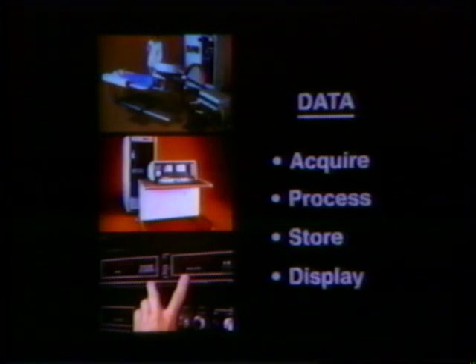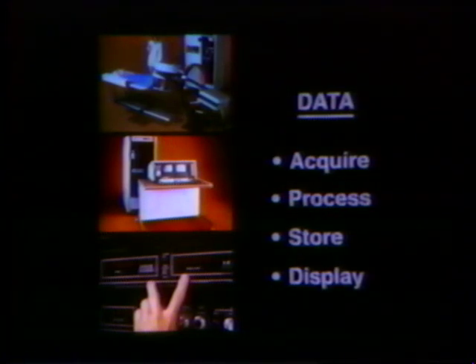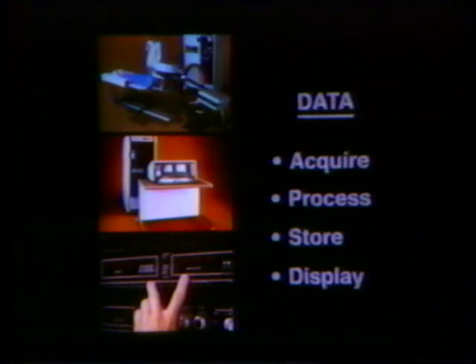A nuclear medicine computer system is a device which provides acquisition, processing or mathematical manipulation, storage, and display of data from a gamma camera. It allows the user to acquire each event as it is detected by the gamma camera and at a later time mathematically analyze these events in the form of images or numerical values.